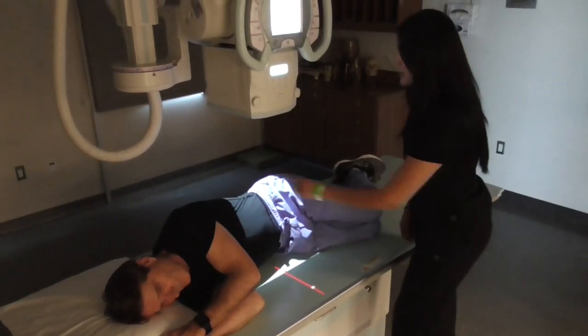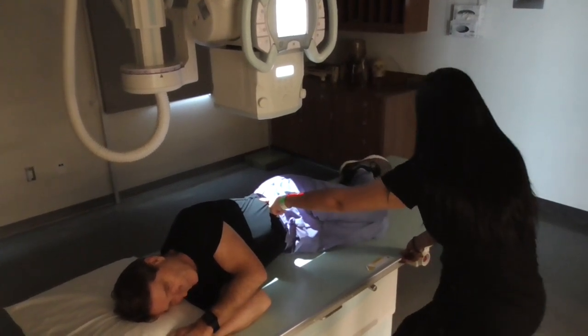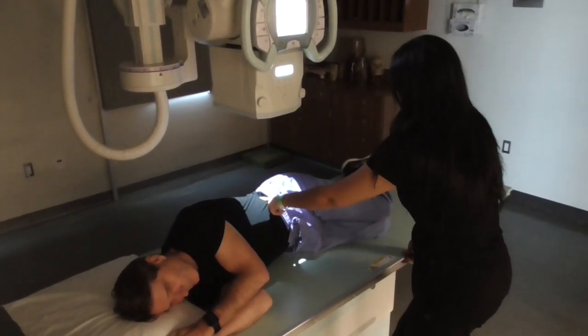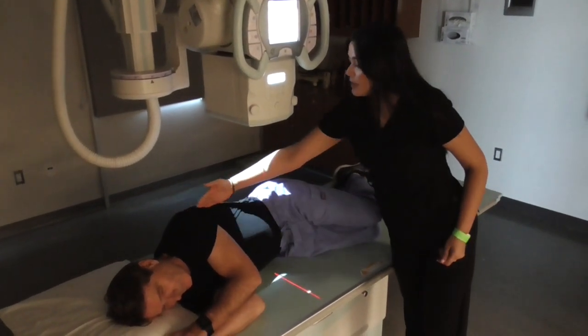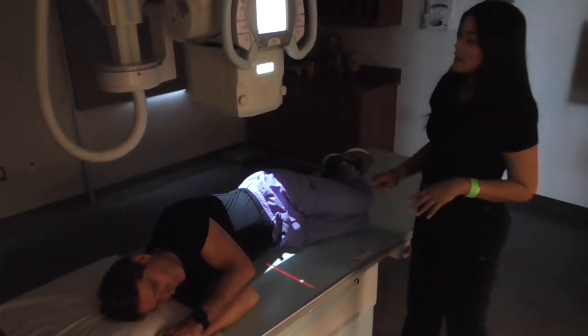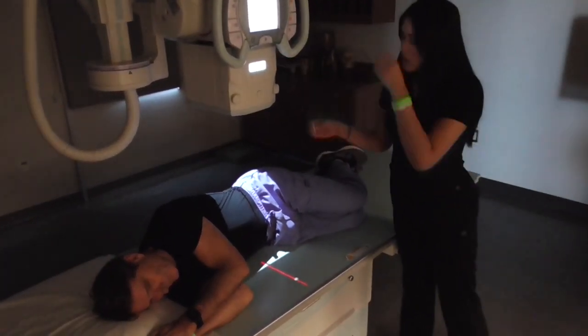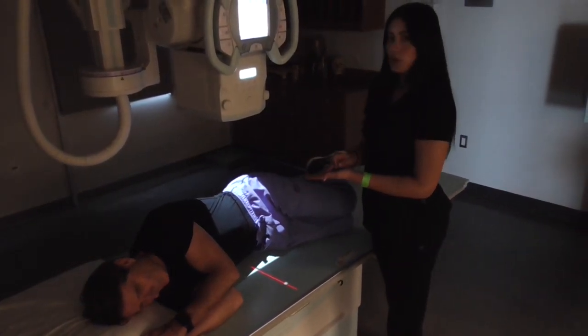I will be centering at the level of the iliac crest, which I am right there — the iliac crest — and to the mid-coronal plane. I would make sure to mark the right side, because that is the side that is down, the side that is closest to the IR.